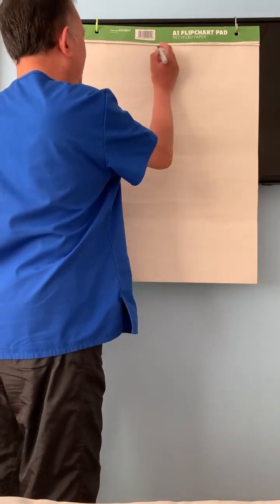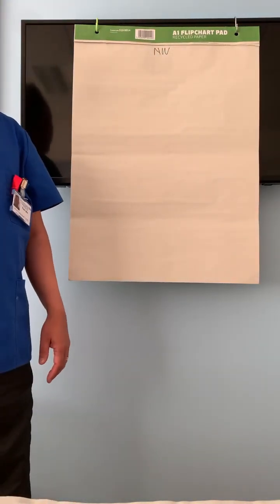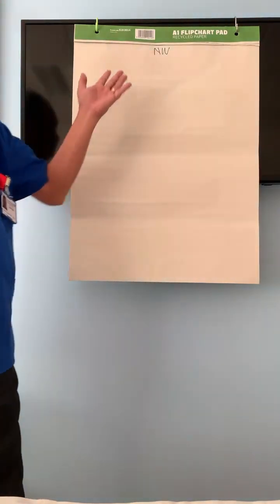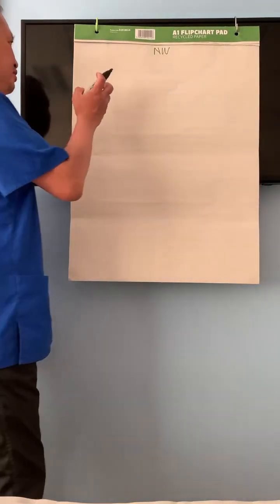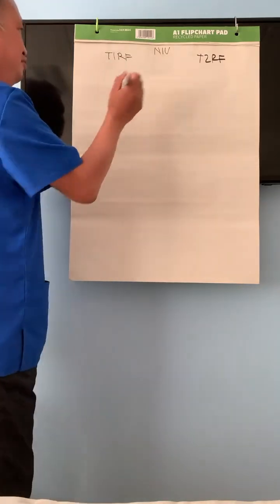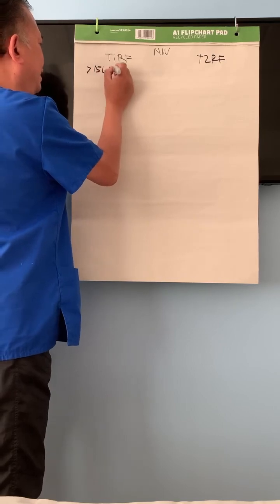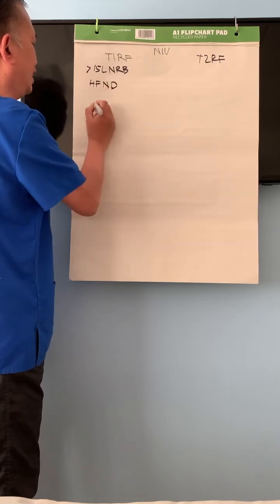45 minutes. Okay. So now we will go to non-invasive ventilation. I will leave the HFNO for later. Better to tell it at the same time. Type 1, type 2. Type 1 should be very quick. In type 1, usually if you cannot maintain with more than 15 liters on a non-rebreather mask, we go into HFNO or CPAP.